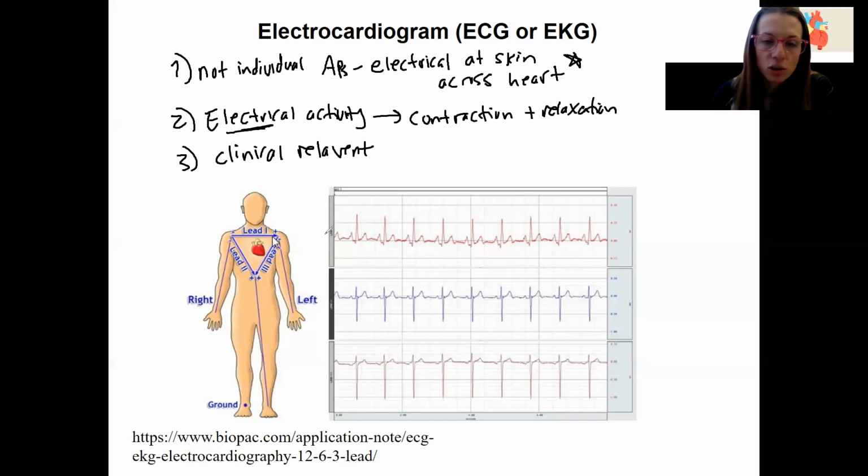So depending on these three different electrodes, you would get different signals that look very different because it's all relative to where that electrode is when it's measuring. There's different types of EKGs you can do, with electrodes in different places. We'll just do one so that you can learn that one. I do want you to be able to understand this basic idea here.